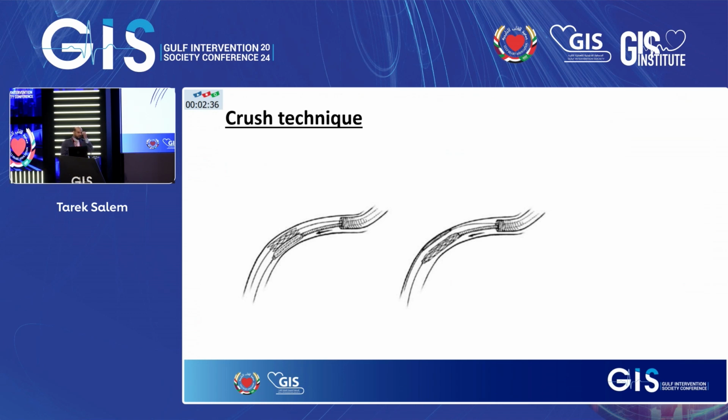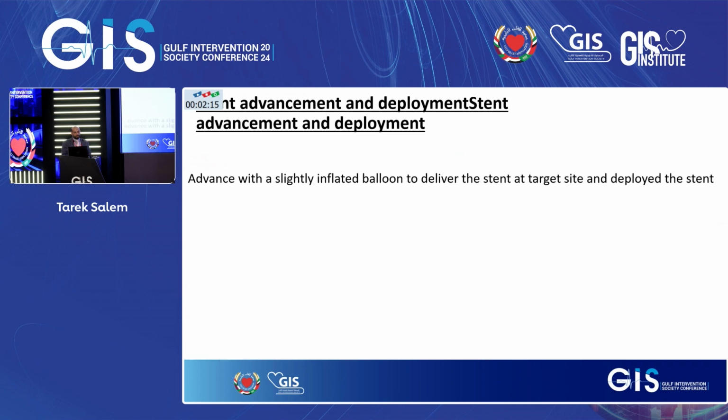So at this stage, I'm thinking I've lost my wire. What do I do next? Obviously, the patient here was having pain in her arms, unfortunately, because of spasms. Lost my wire. Do I speak to a surgeon? Anyways, I think it's important to address all these things at the back of your head. Ask your colleagues to come and help you out.